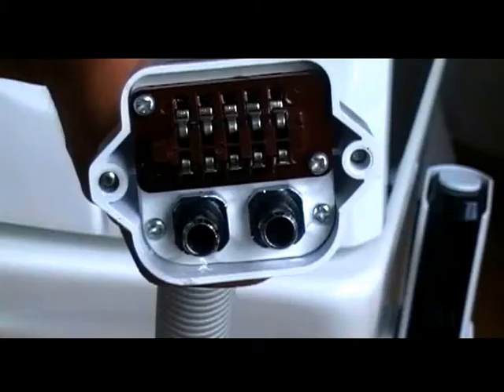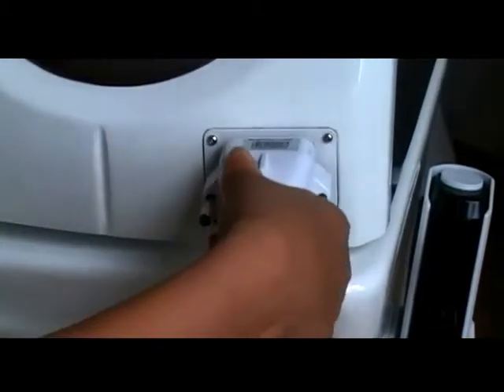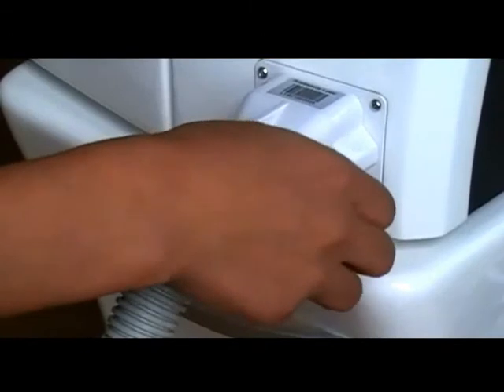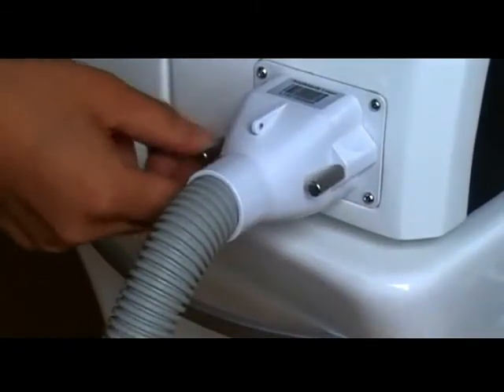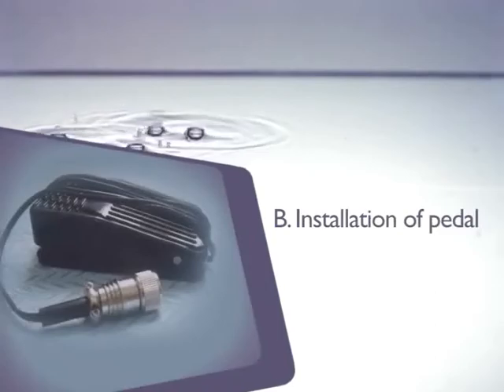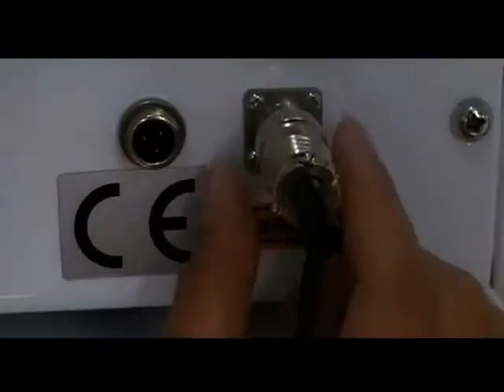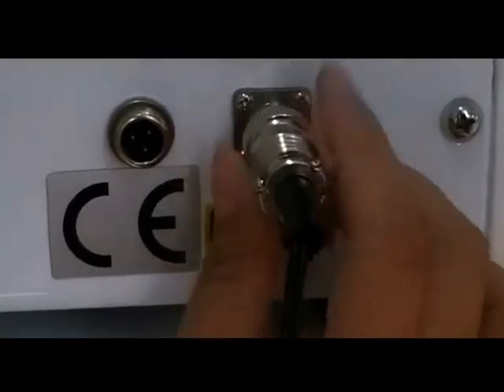Fit the end of the hand piece together with the machine and screw it tightly. Installation of pedal: keep the small gap upward, insert the connector, then push it inward mildly and screw it tightly.